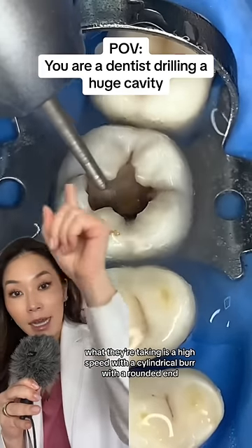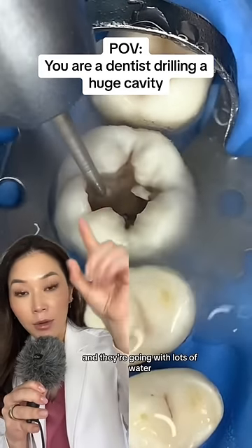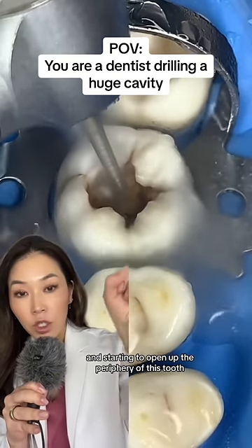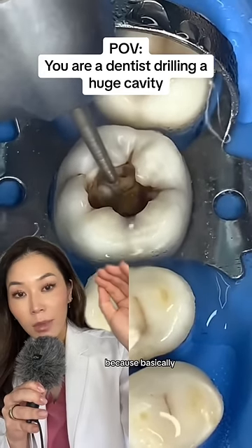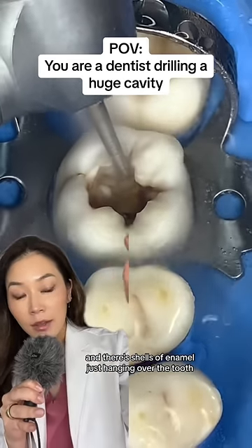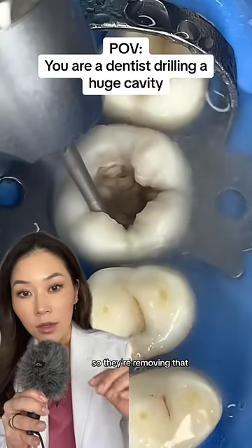What they're using is a high-speed drill with a cylindrical burr with a rounded end, going with lots of water and starting to open up the periphery of this tooth. They're trying to remove any unsupported enamel, because basically the whole inside of the tooth is eaten out with cavities and there are shells of enamel just hanging over the tooth, so they're removing that.